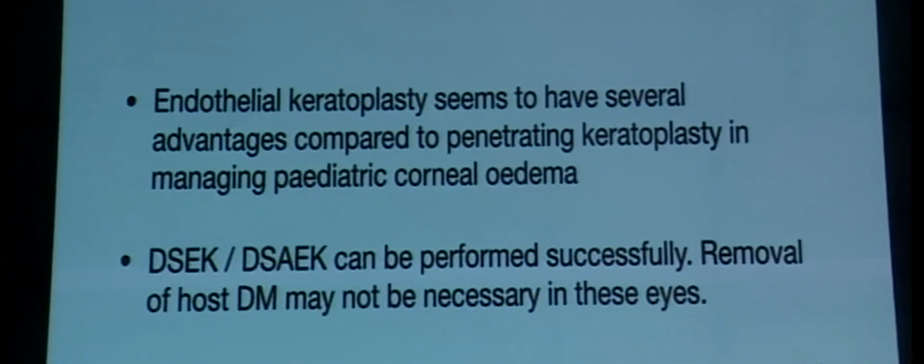So endothelial keratoplasty seems to have several advantages compared to penetrating keratoplasty in managing pediatric corneal edema. DSEK can be performed successfully. Removal of host Descemet's membrane may not be necessary in these eyes, and an attempt to remove the host DM can sometimes make your inner surface very irregular. DMEK using gas tamponade with either SF6 or C3F8 non-expansile mixture can be attempted, although surgically challenging when compared to DSEK.